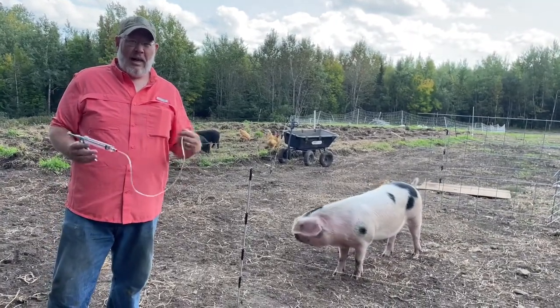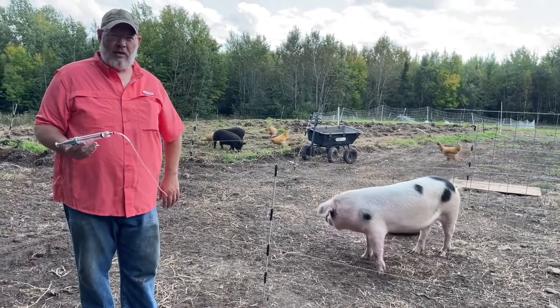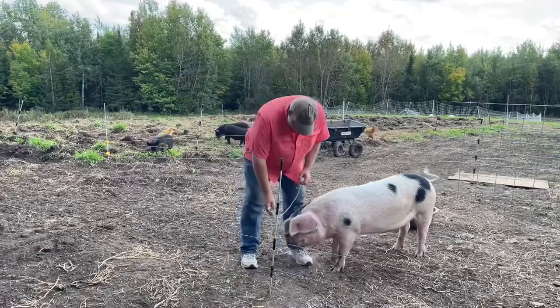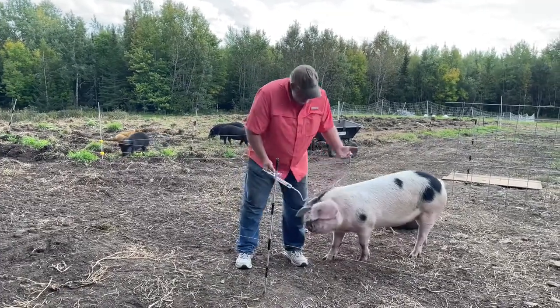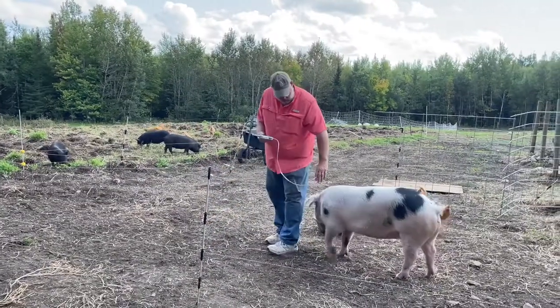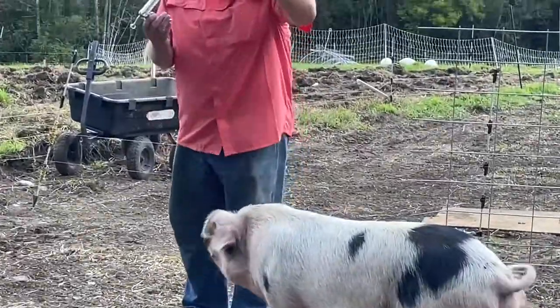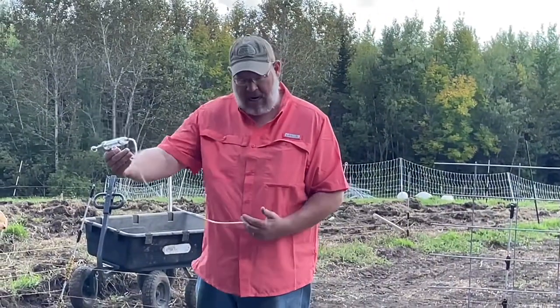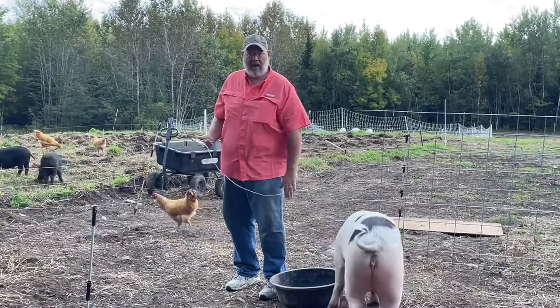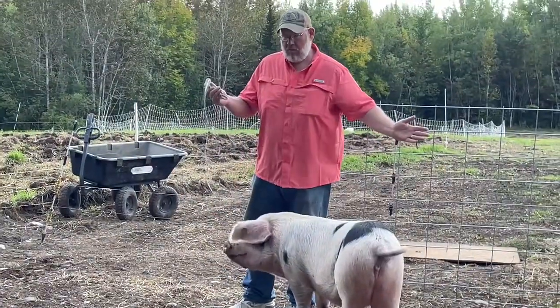I'm not going to have an injection today, but I am going to step into the pen with a few of the pigs and kind of show you. They've had it many times, they know what it is — they can smell it. In order to administer our dose, most injections on a pig you're going to go right behind the ear, right about here. So if I have the slap shot in my hand and the dosing needle in this hand, if I give the pig some feed or have them preoccupied, I can come up to the pig, slap it, let it go, and give the dose.